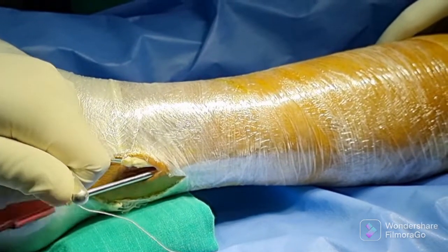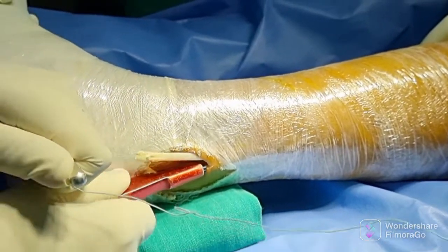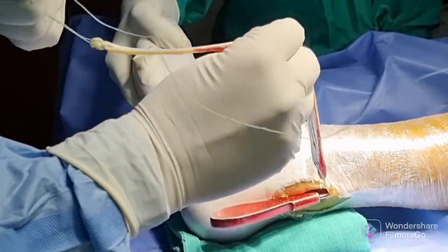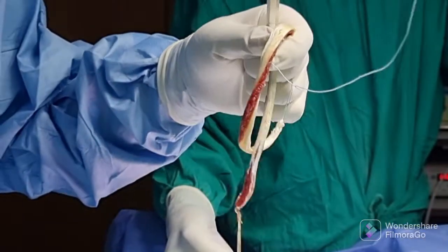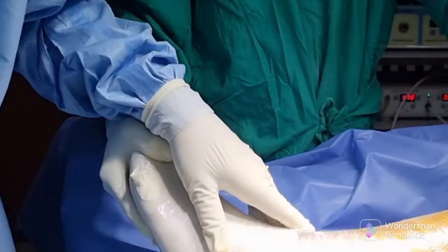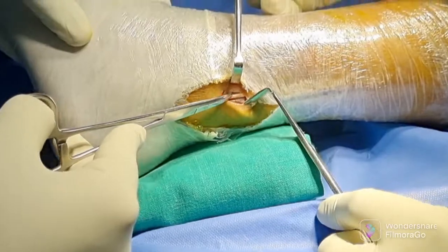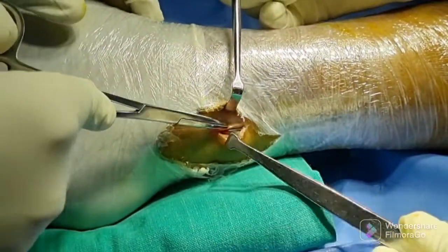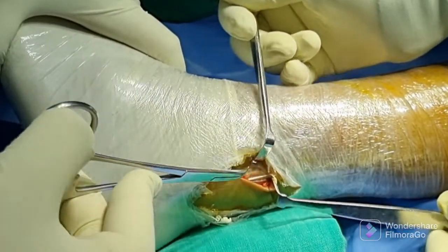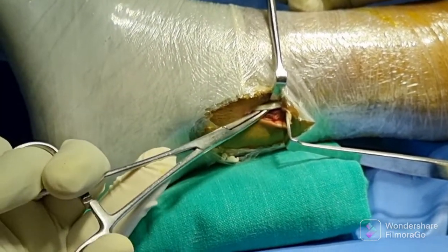Here you see the two-third part of the tendon has got an adequate thickness which will suffice for your ACL or PCL reconstruction. You can see the one-third part of the tendon is still intact and is functioning well, exerting eversion power over an artery forceps.